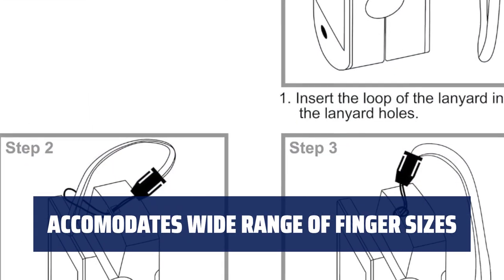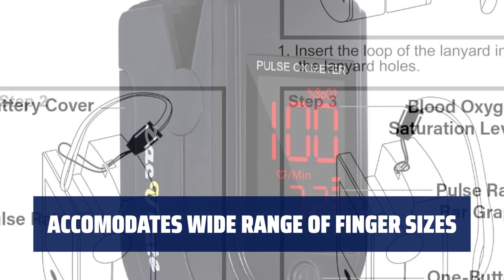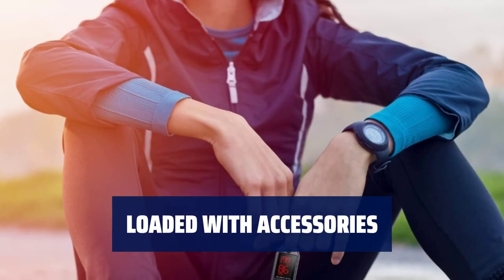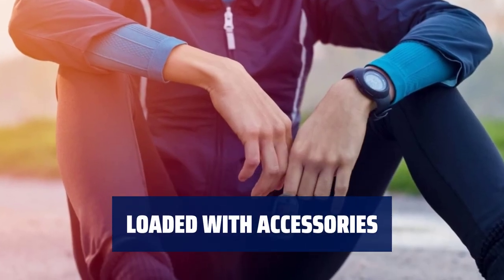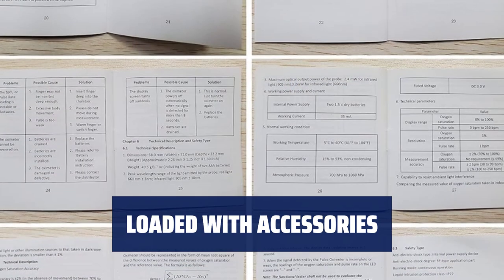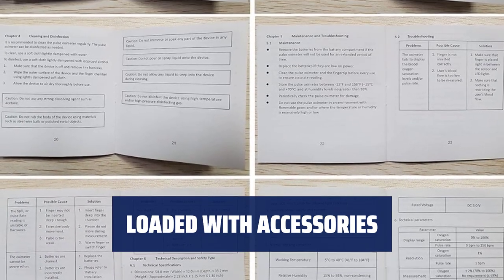The finger chamber with a smart spring system fits a variety of finger sizes, suitable for ages 12 and above. Includes two AAA batteries for immediate use, a silicone cover for protection, and a lanyard for added convenience. Also comes with a 12-month warranty and USA-based technical support.